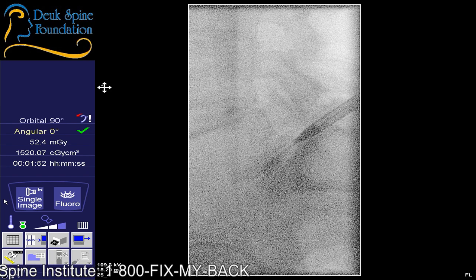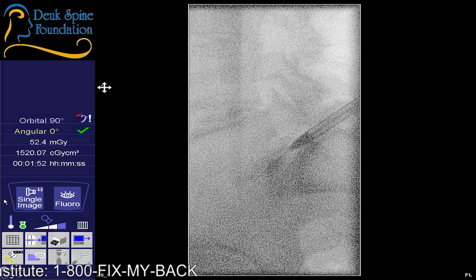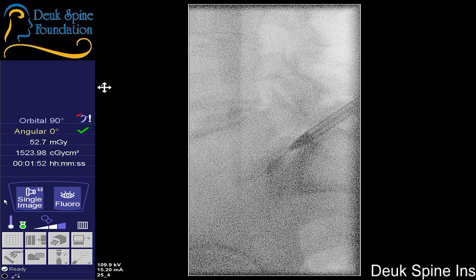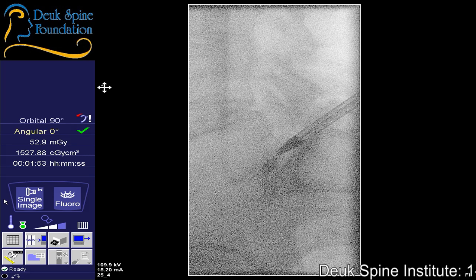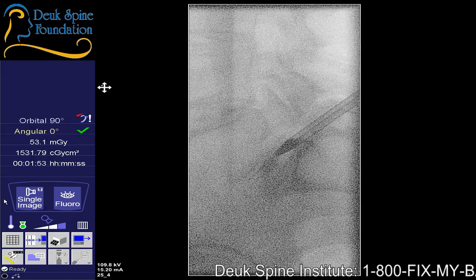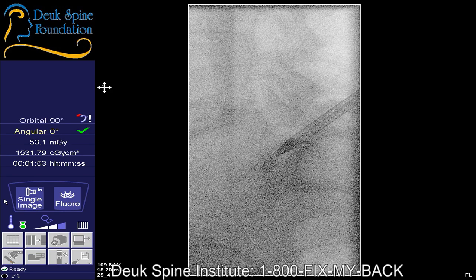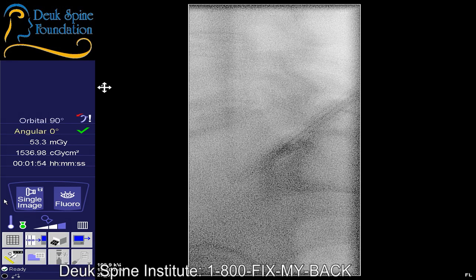This is definitely the hardest level to get to. Normally, and honestly, we have a very nice patient, so I don't want to say anything, but this is a challenge. I mean, really a challenge, even for someone like me who's done 1,000. I rarely have given up on a level because it's not safe to do, and I just can't access it, but we're really lucky that we got into this level. I was very concerned at one point that we weren't going to make it.